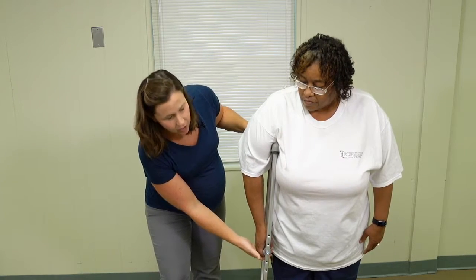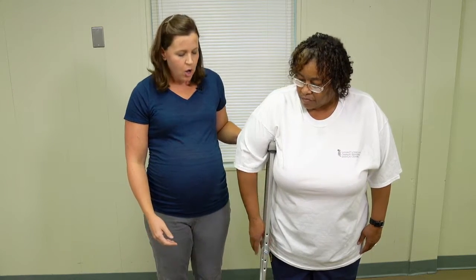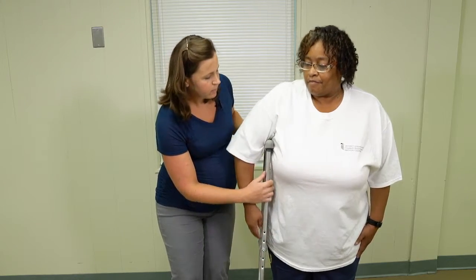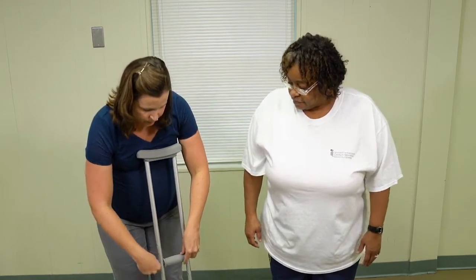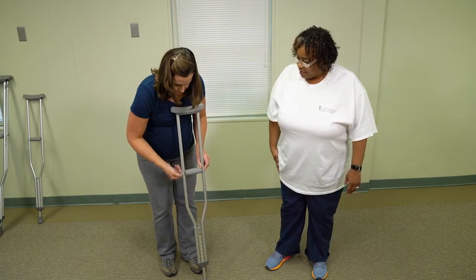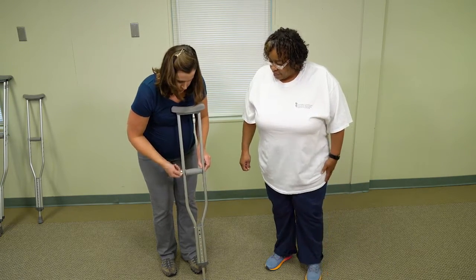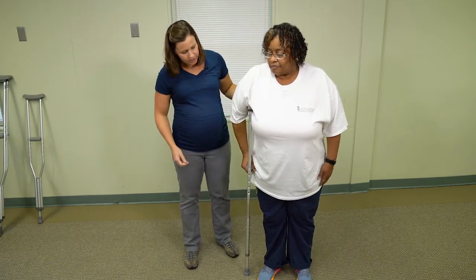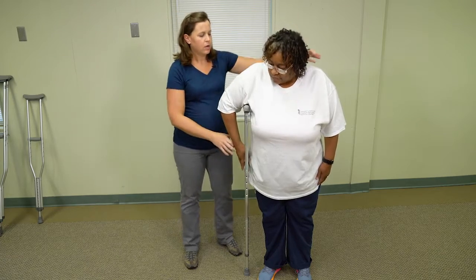Adjusting the hand part is going to be the next important part. When the patient has their arm down by their side, where their wrist bends is usually a good spot to try to line the hand up at. So I just moved it up to the top handle. And then recheck the position. Go ahead and turn for me.